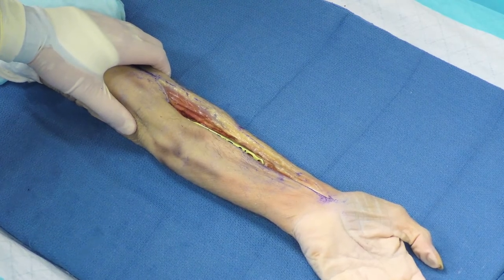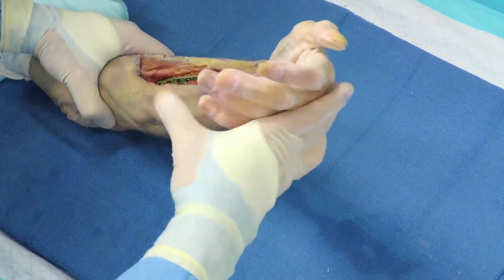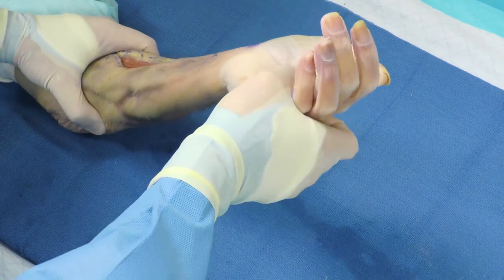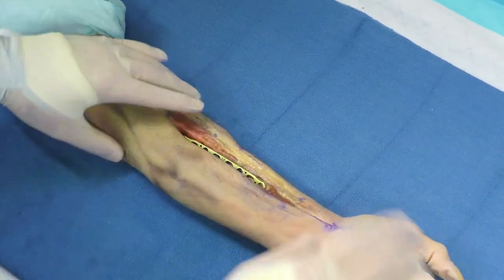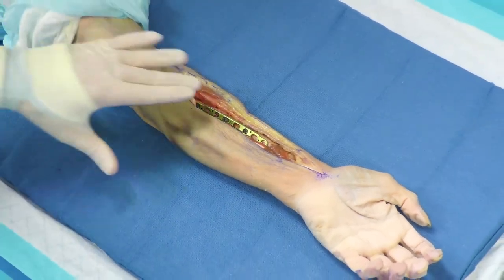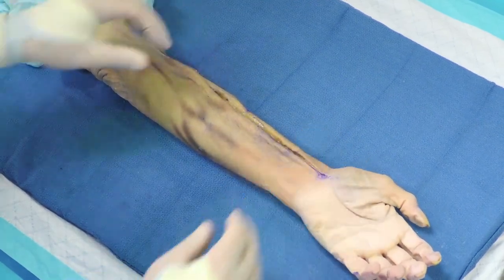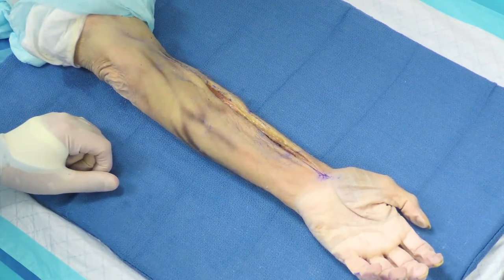The last thing I do clinically is ensure the patient has full pronosupination. I put them through a full range of motion — pronation and supination — holding the elbow to confirm motion is coming through the forearm. Once clinically satisfied, we proceed with standard closure: we do not close the fascia in the forearm, and close only the subcutaneous soft tissues, dermis, and skin with interrupted nylon sutures or your skin suture of choice.